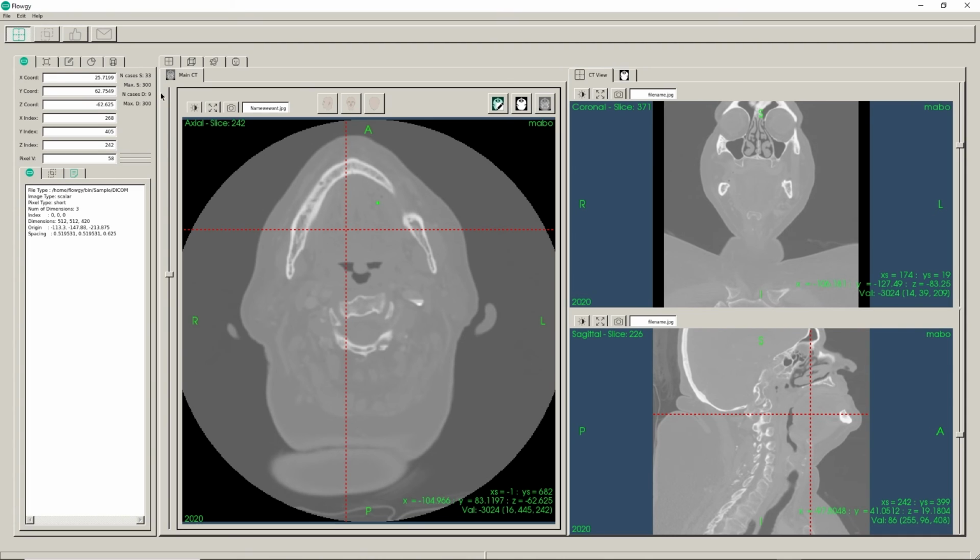These were already the basic elements of the CT scan or similar. Not that complicated, right?